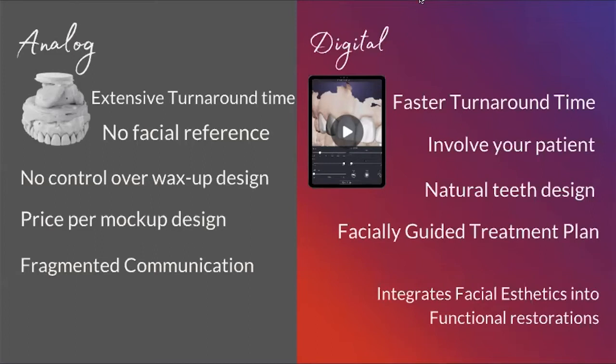So now, since I have a lot of amazing doctors like you here today, I want to know if you create your own dental wax-ups in your practice, or if you outsource your dental wax-ups, or if you don't do any of that. So I have placed a poll. Just please give me an answer.